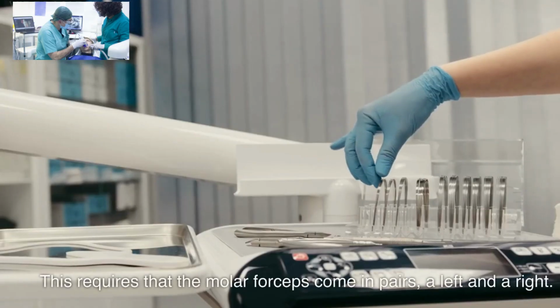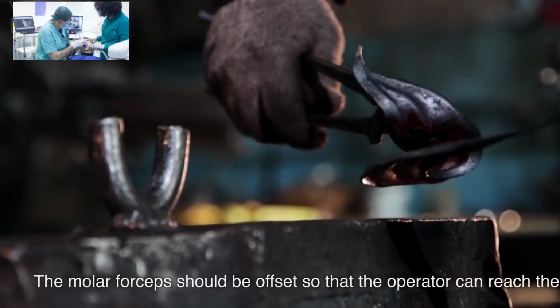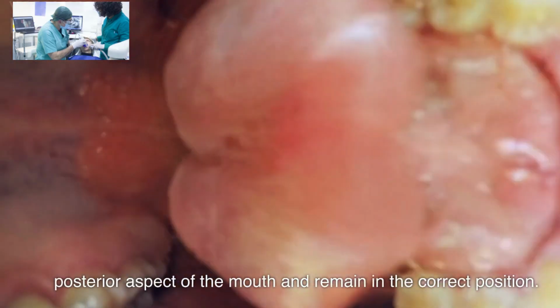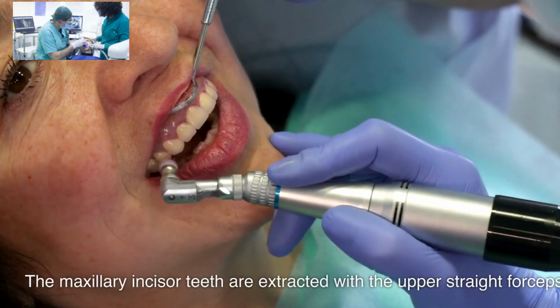This requires that the molar forceps come in pairs, a left and a right. The molar forceps should be offset so that the operator can reach the posterior aspect of the mouth and remain in the correct position. The maxillary incisor teeth are extracted with the upper straight forceps.